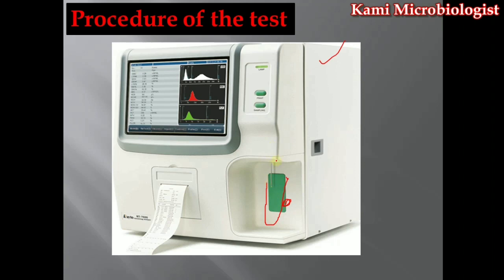After that, within 5 to 10 minutes, they will give you the report, and they will not only give you the MCV report, they will also give you all the CBC parameters like TLC, DLC, MCV, MCH, MCHC, HCT, all types of CBC parameters.